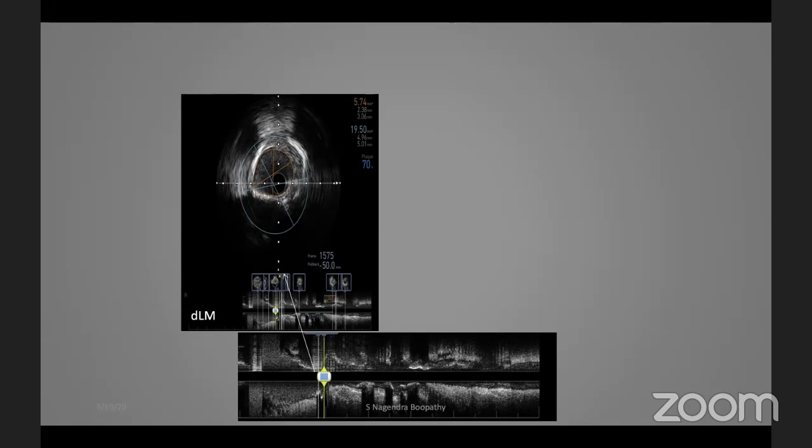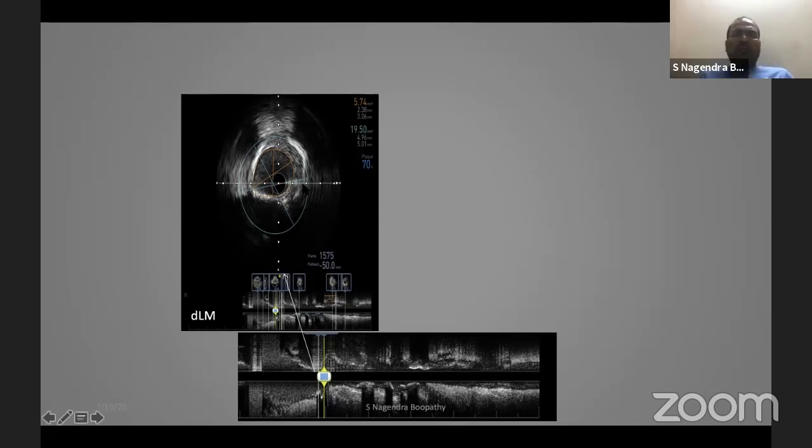See, if you have the vessel, the lumen, the actual thing, not the plot, the outer wall from say 4 o'clock to 7 o'clock, how did it come to that curve? How do you draw this line? This is only an approximation, sir. We go proximally to the near normal left main segment, look at the diameter of the EEM there, and put an approximate EEM with the same diameter here.